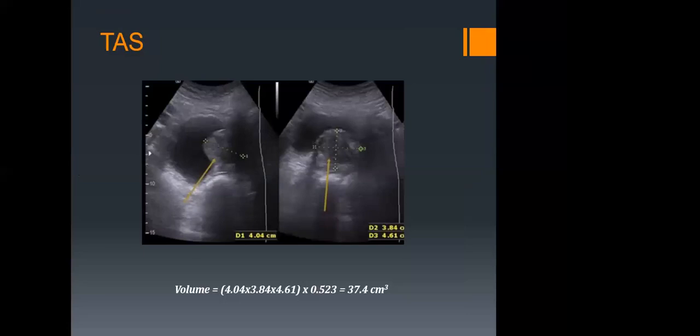Now, when we go to transabdominal, you have already seen this image. You can see, that is our urethra there, the V sign, and this is our prostate. But this is our actual image, but you really can't appreciate enough of it. Right? Even when you look at the capsule, you can't really define it. And the pubis is obscuring you from obtaining the actual contour of the capsule anteriorly. This is why we are discouraging the transabdominal.